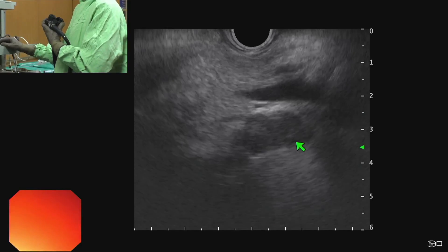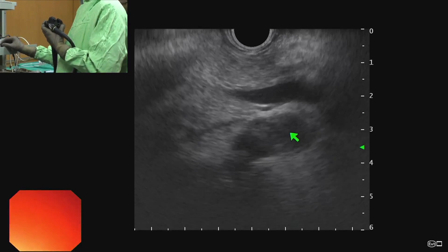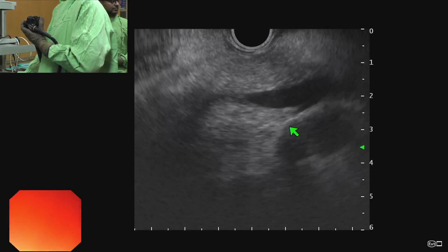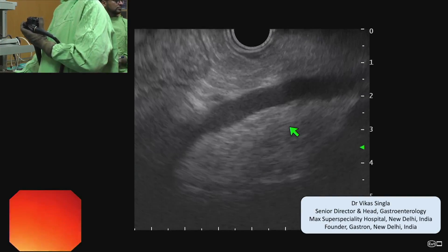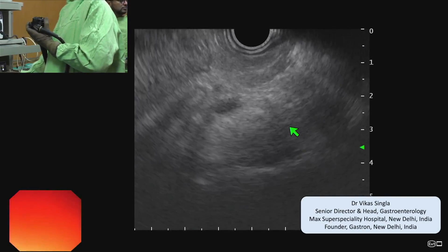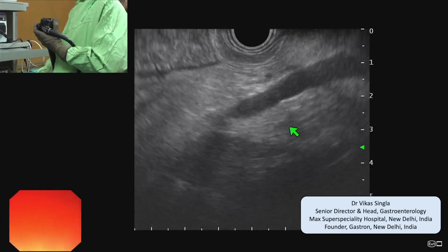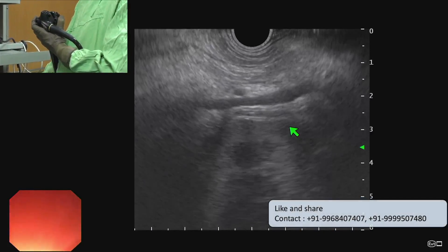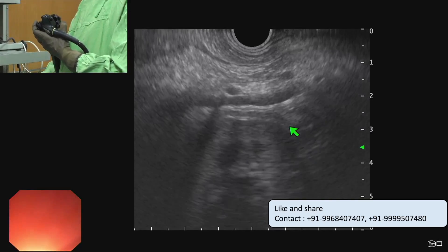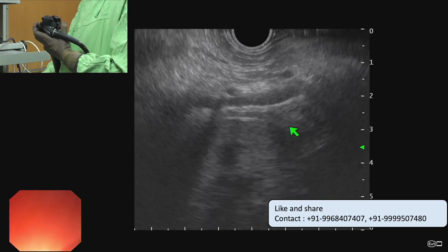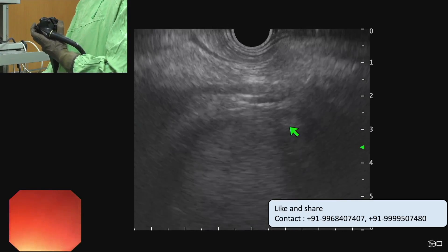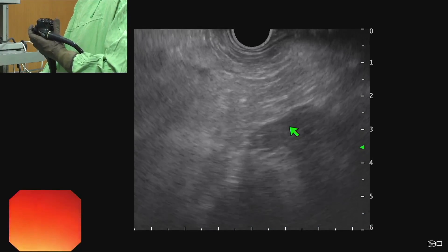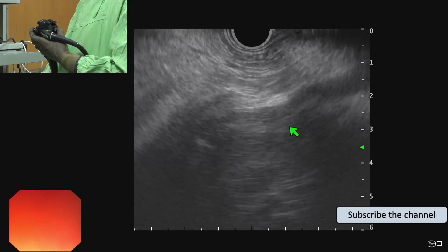By pushing the scope from this position we trace towards the superior mesenteric vein. We can see we are pushing the scope inside and tracing the portal vein as the SMV. From the SMV, if we rotate clockwise we can see the SMA. Nodes around the SMA and SMV on CT scan can be easily targeted from the mid-gastric or distal gastric body.